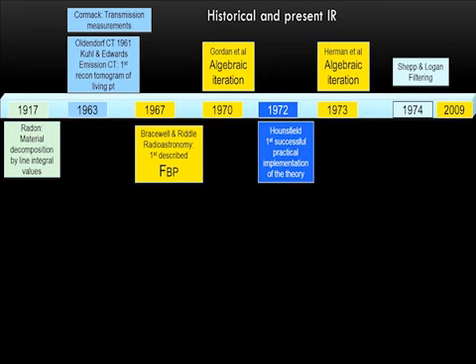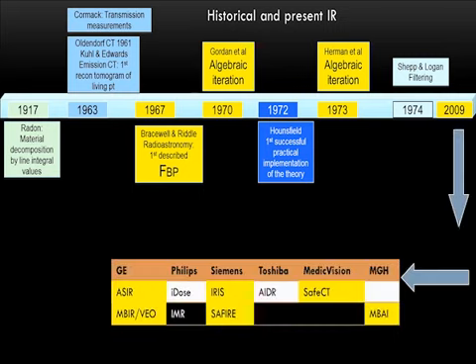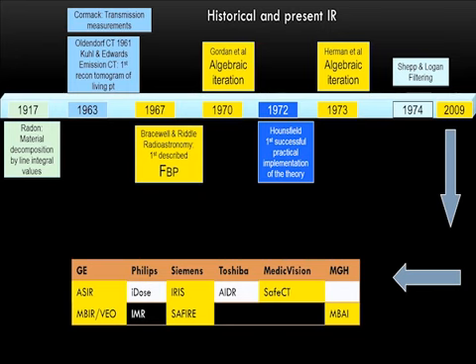Then in the 1970s, Gordon introduced the algebraic reconstruction technique, which was used in the first EMI scanner. But filtered back projection, or FBP, was used for CT imaging because we had good enough signal, and for emission tomography we had low signal, and that's where IR was developed and refined in the 1980s. To my best knowledge, somewhere around the early 2000s, when we were trying to lower our doses, we ran into this domain of low signal in CT. With computational power coming up, with higher-end GPUs and PCs, we rediscovered IR and it came back to the CT domain.